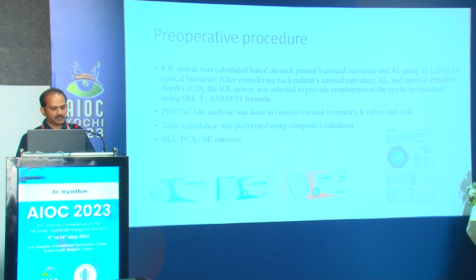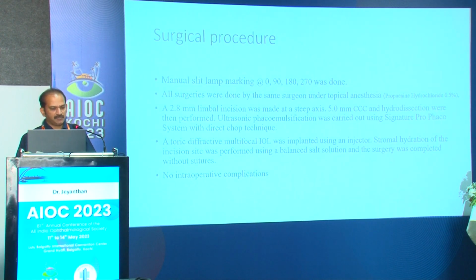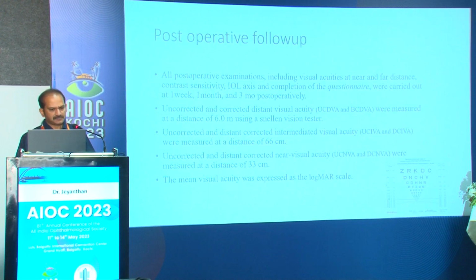The Pentacam analysis was done to confirm the corneal symmetry, K values, and the axis. Toric calculation was performed using the company's own calculator. The surgery was done by a single surgeon under topical anesthesia with manual slit lamp marking. There was no intraoperative complication and no sutures were placed at the end of the procedure.